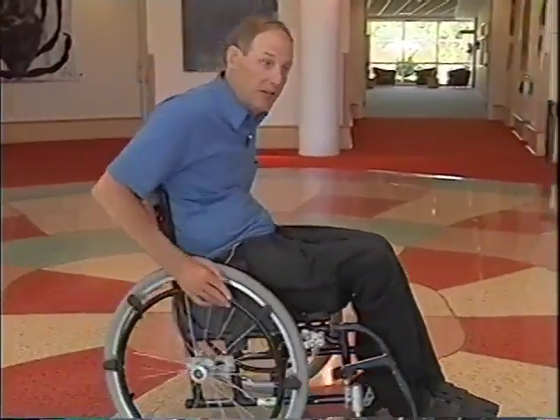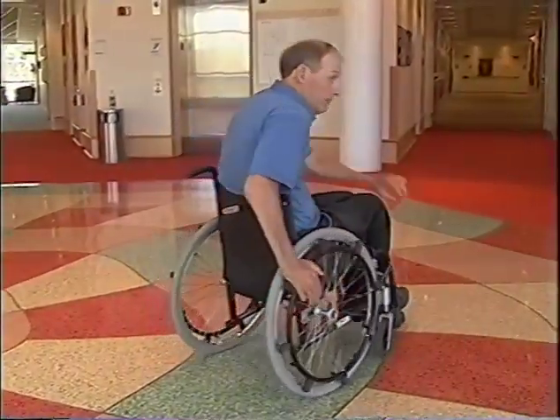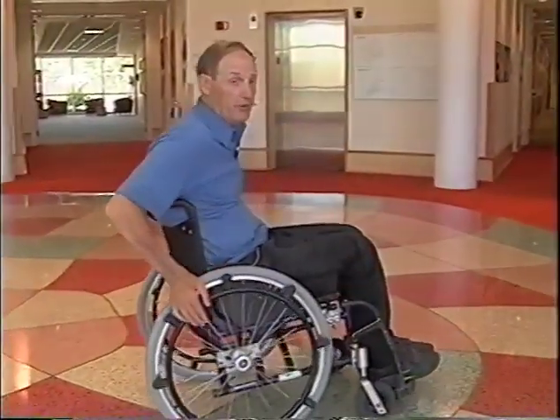But once you get this down and feeling the projections come by your hand with the bumping, then you'll know where to plant it. But beyond that, once you get that down, you can just forget about it. Your hands will automatically know where to go. Very frustrating to start, and all I can say is hang in there, and you'll get it eventually.